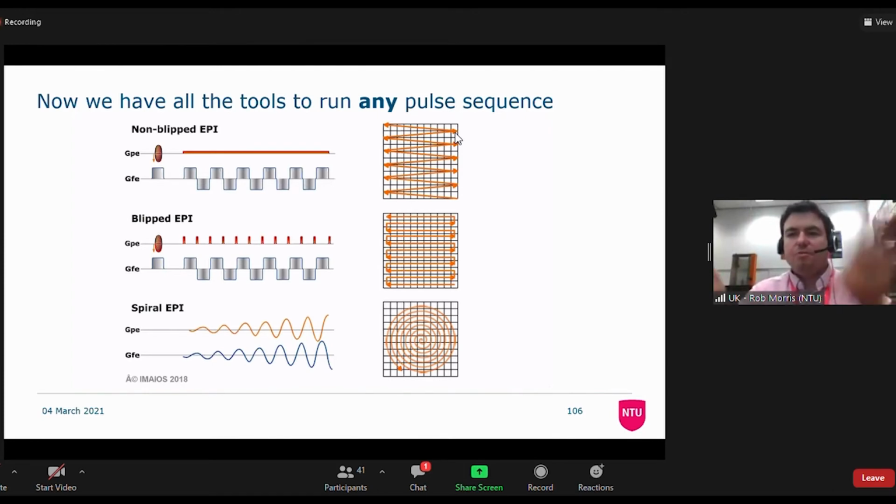So when we do neuroimaging and you want to look at brain function, this is the sequence of choice, because we might get an entire image. It'll be low quality and pretty low resolution, but we can get images like this in quite a bit under a second, and then it gives you really high resolution in time.